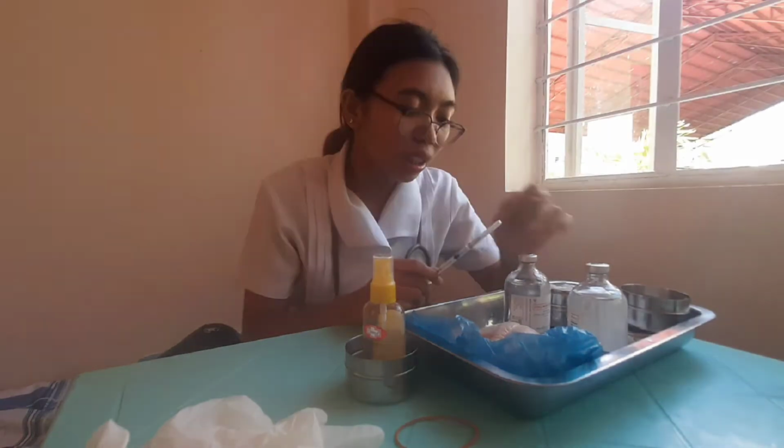Then also alcohol swabs. Wala ko alcohol swabs, but I have here some cotton. Then atara siya ikuan. And then 2x2, which is a sterile gauze square. So I'll just assume nga ito ta. And then also clean gloves, which is according to the agency protocol nga needed kaayo. Bandage also, and then epinephrine on hand in case of an allergic or anaphylactic reaction.